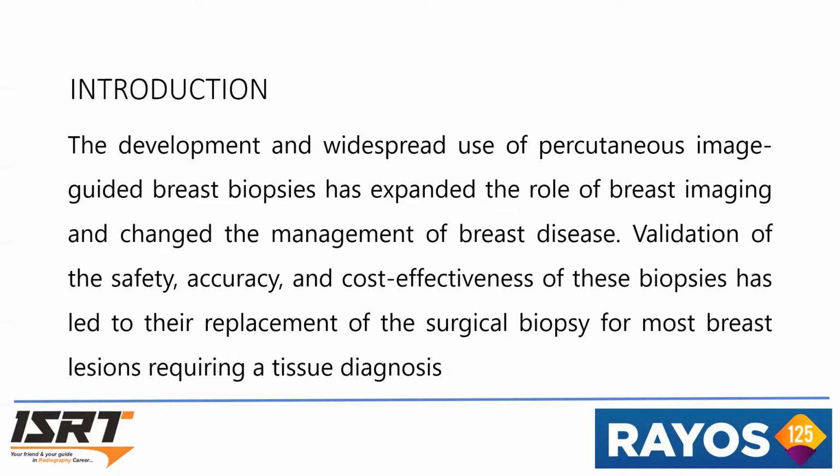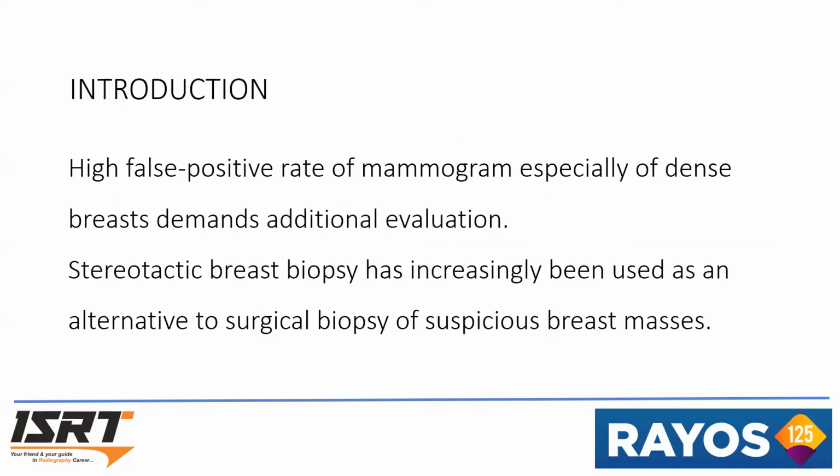Validation of the safety, accuracy, and cost effectiveness of these biopsies has led to the replacement of surgical biopsy for most of the lesions which require a tissue diagnosis. The high false positive rate of mammogram, especially of dense breast, demands additional evaluation. Stereotactic breast biopsy has increasingly been used as an alternative to surgical biopsy of suspicious breast masses.